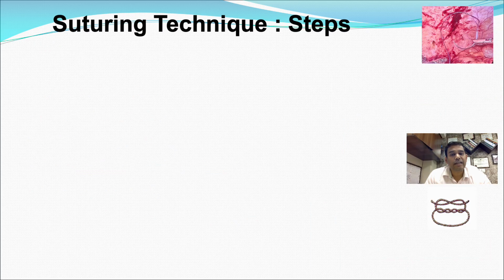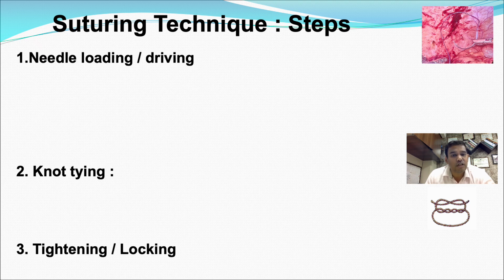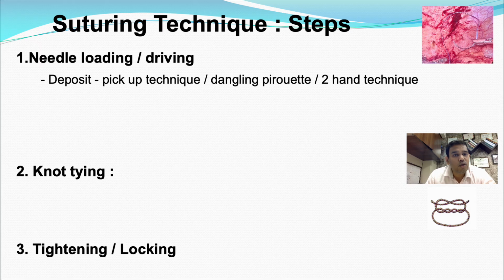Now, the suturing technique you divide into steps. The first is how you hold the needle or load the needle onto the needle holder and drive through the tissue. So the first part is you load the needle over the needle holder and drive through the tissue. Second is knotting. What configuration of knot you would like to have and how you do the knotting. And third is tightening the knot or locking the knot properly. So first is needle loading.